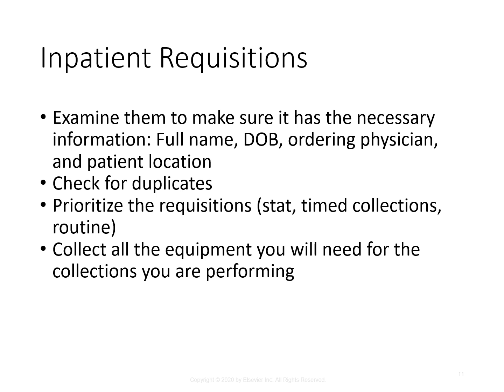You're going to prioritize the requisitions. Stat is always going to be first because that is immediate. They need that now. Timed collections usually need to be drawn within 15 to 30 minutes of that time. So if it says noon, you need to get there as close to noon as you can to draw that. If it's routine, you're going to follow your facility's protocols on what they state for routine. You're going to collect all the equipment you will need for the collections you are performing.